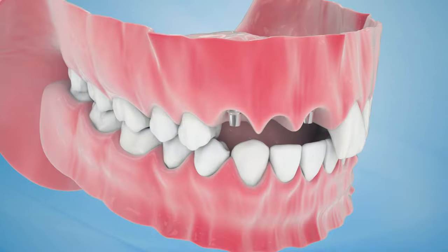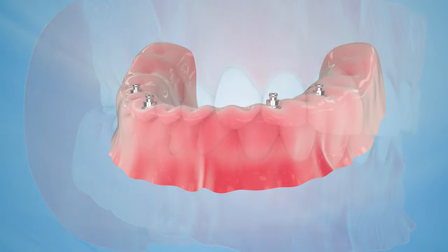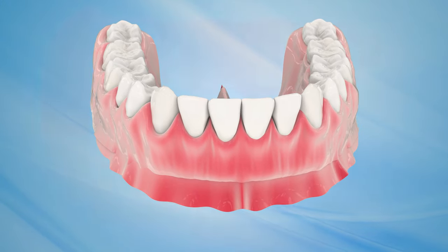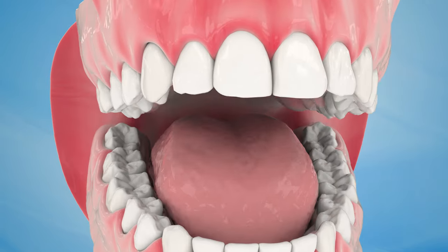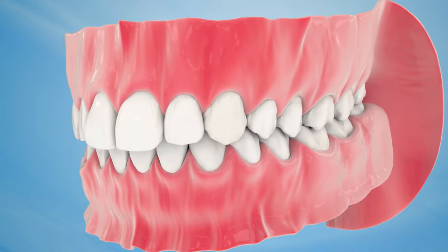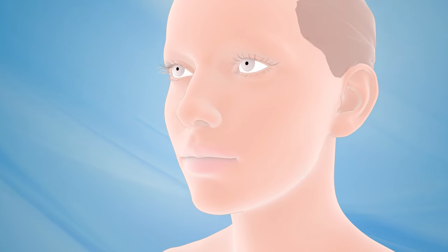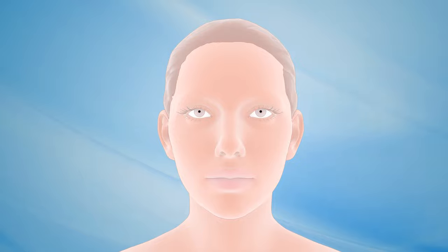To replace more than one tooth, bridges or dentures are customized to fit each patient's individual mouth and implants. Your dentist may give you a temporary crown, bridge or denture to help you speak and chew until your permanent replacement teeth are ready. To ensure successful dental implants, patients must maintain the health of their implants with regular dental cleanings and visits paired with proper oral hygiene practices.